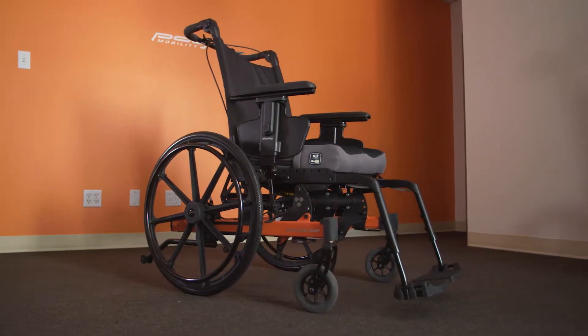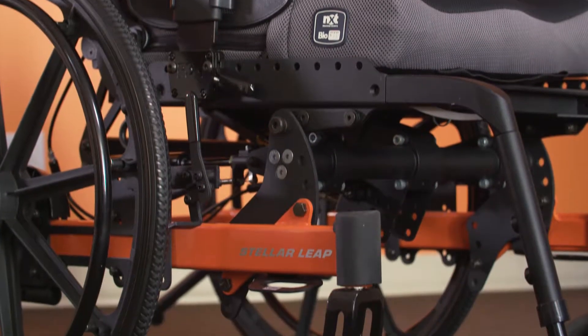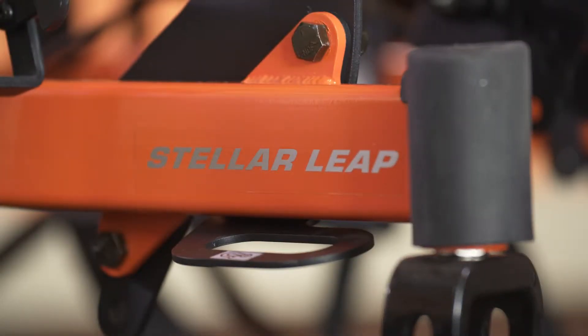Stellar Leaps without a dynamic recline system are fitted with a link bar, which allows the backrest angle to be set when the chair is in posterior tilt.